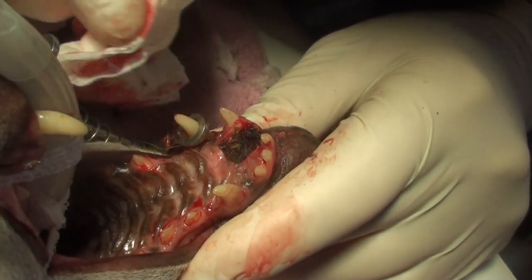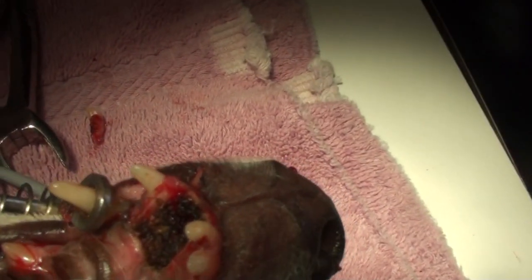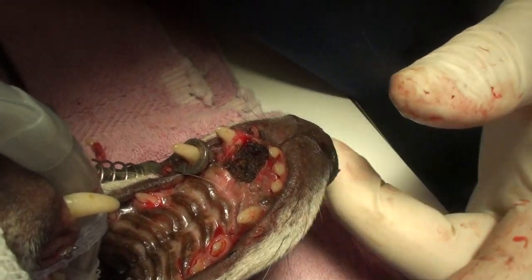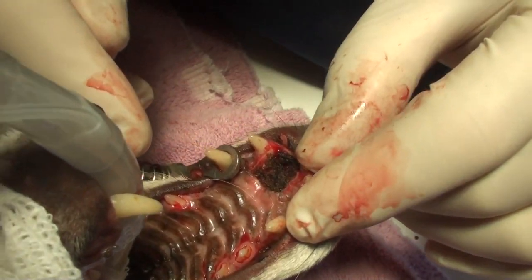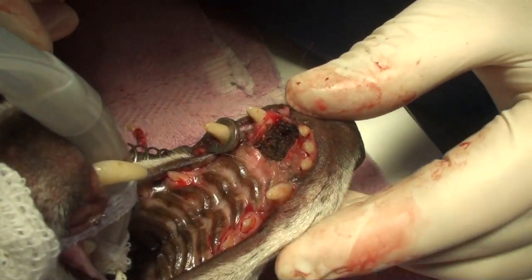So we burned the tumor bed and took out the teeth, and we'll see what happens. We just try to take out as much as we can. We'll put him on antibiotics and some painkillers, and we'll see what the biopsy shows.